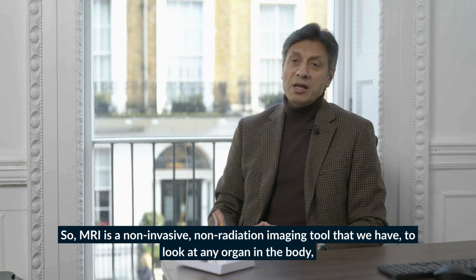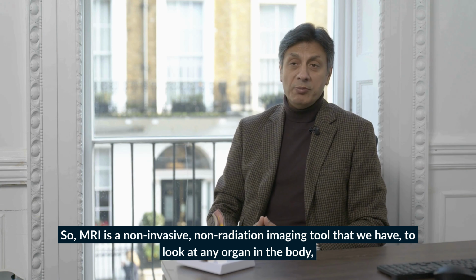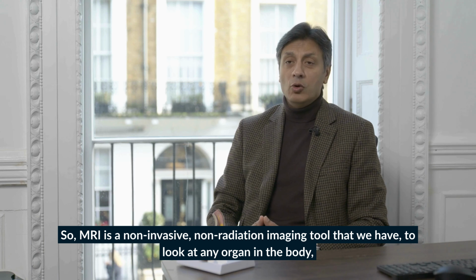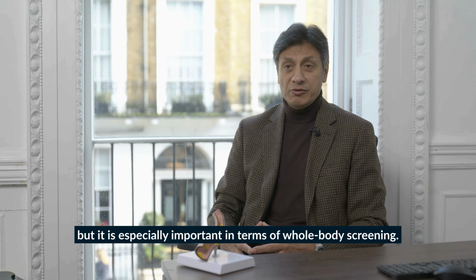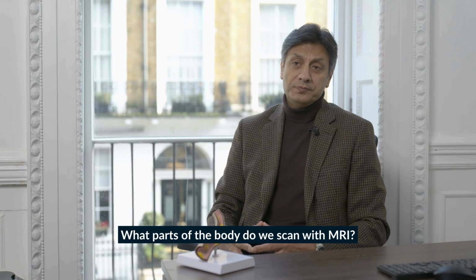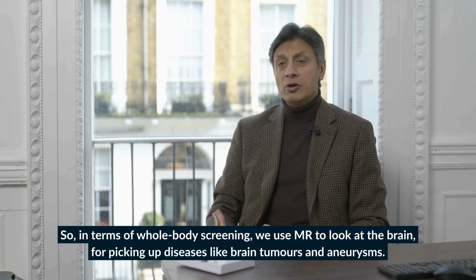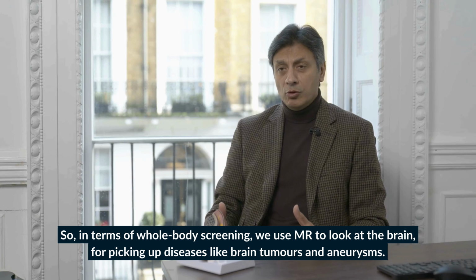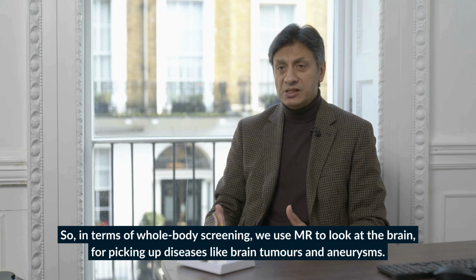What is MRI? So MRI is a non-invasive, non-radiation imaging tool that we have to look at any organ in the body, but it is especially important in terms of whole body screening. What parts of the body do we scan with MRI? So in terms of whole body screening, we use MR to look at the brain for picking up diseases like brain tumors, aneurysms.